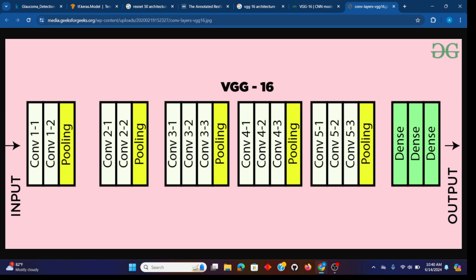Feature extraction means we are just freezing this base and not retraining it. We are using the weights it has already learned from the data available in the ImageNet dataset. Here we are doing eye classification, which is not related to the objects we deal with in real life, like shoes and pants. I think it has 1,000 classes, which are pretty different categories.